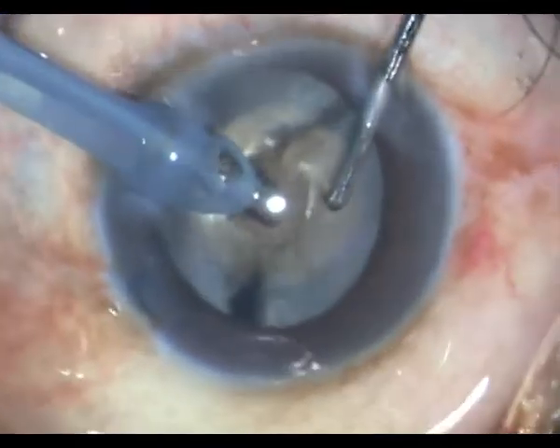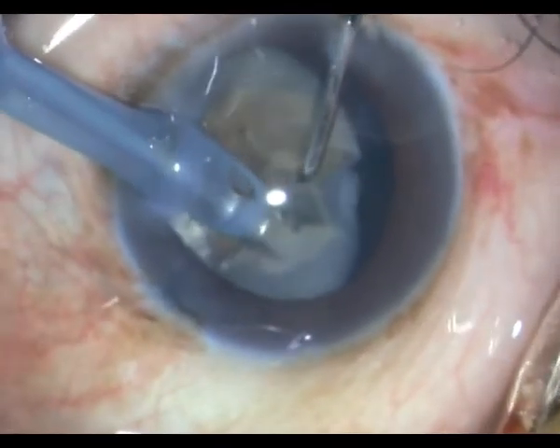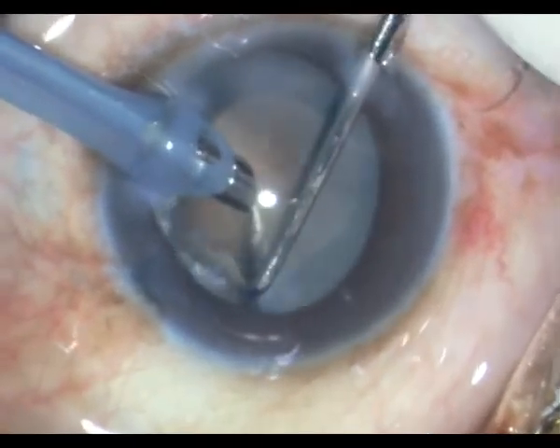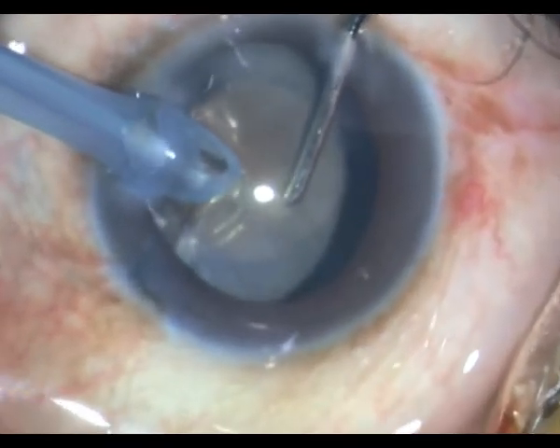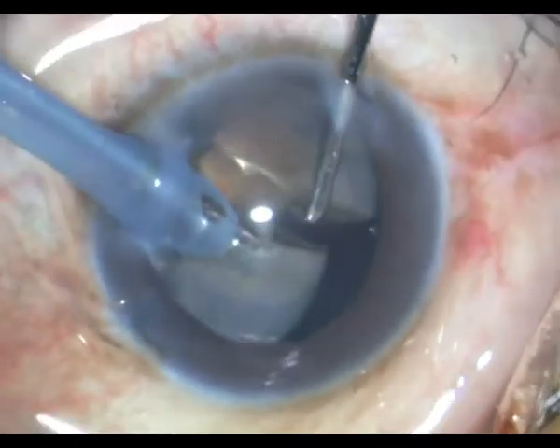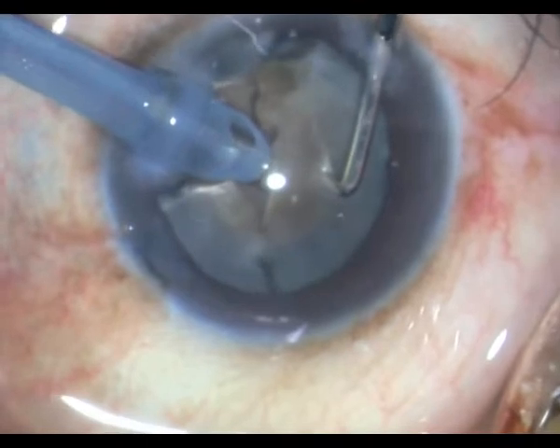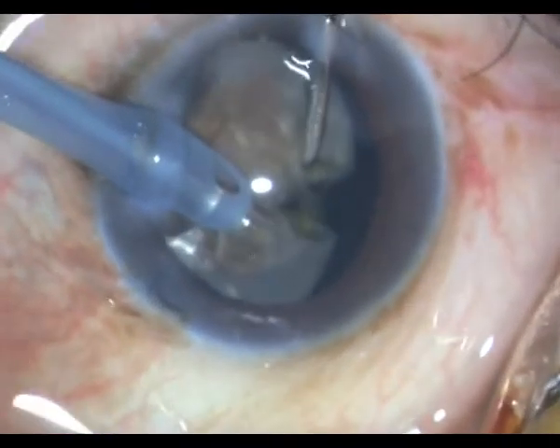You can see if you do this boldly you can fragment the nucleus pretty easily. This is a pretty hard nucleus. I am almost at 80 to 85 percent FACO power going in continuous mode and performing my woodcutter's technique.